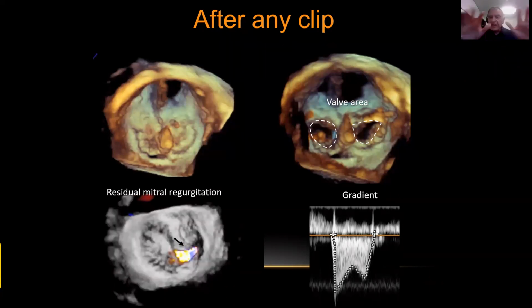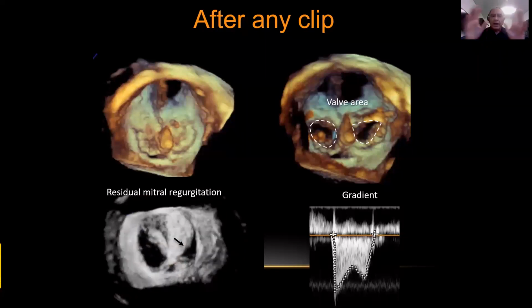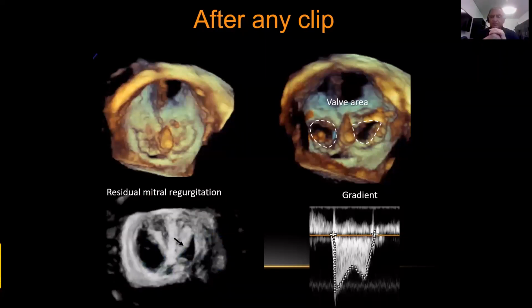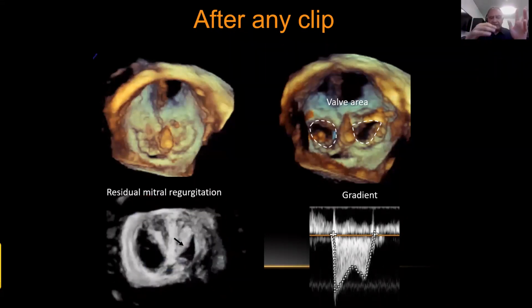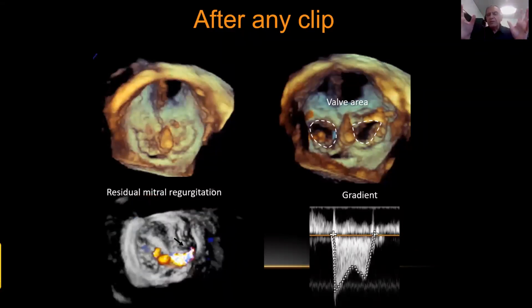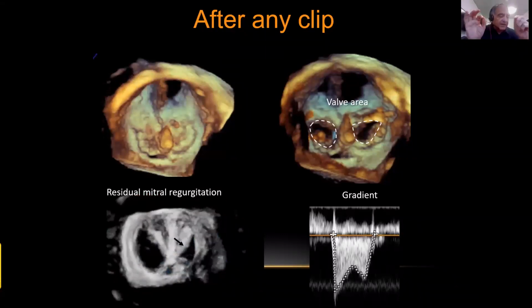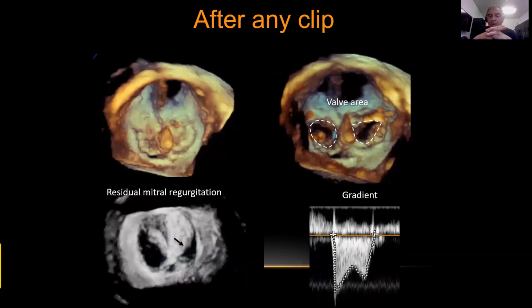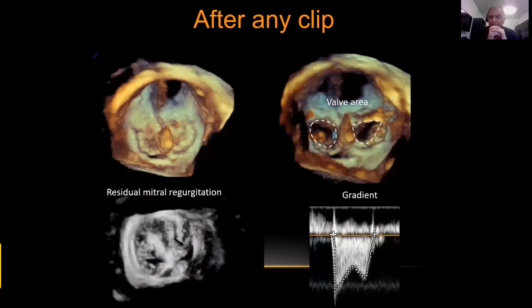We just sit down, stop, calm down, and say, okay, listen to the clinical picture of this patient, how old they are. Would the residual mitral regurgitation impact survival? And then in the end we decide. Fortunately, there is a really very good thing: there is no increase of cost in placing a second, a third, or a fourth MitraClip.